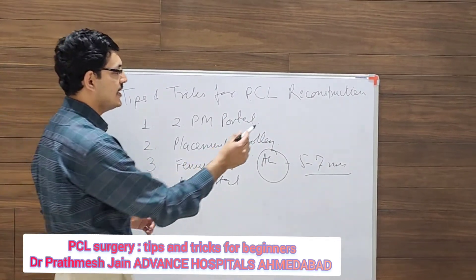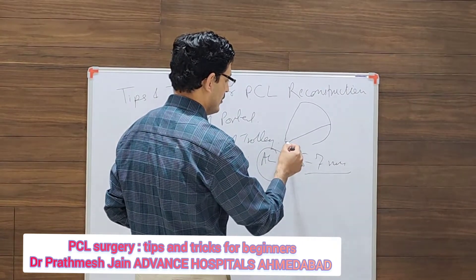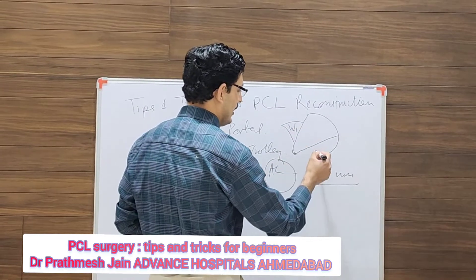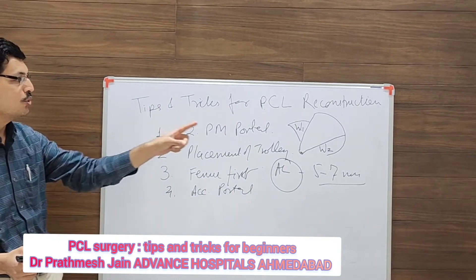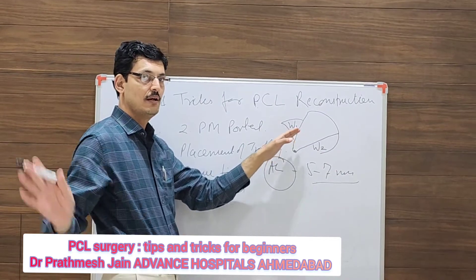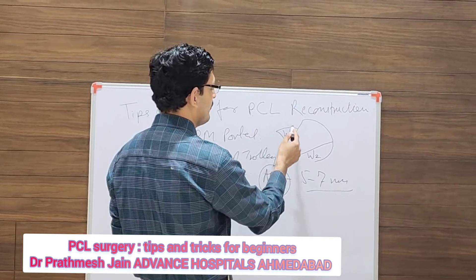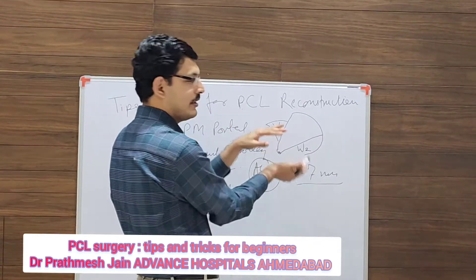The PCL is right here — above it will be the intermuscular septum. Make two windows, W1 and W2: W1 is above the PCL and W2 is below the PCL. This will help in accessing the posterior portal and will aid in visualization. You can pass your graft either through W1 or W2.